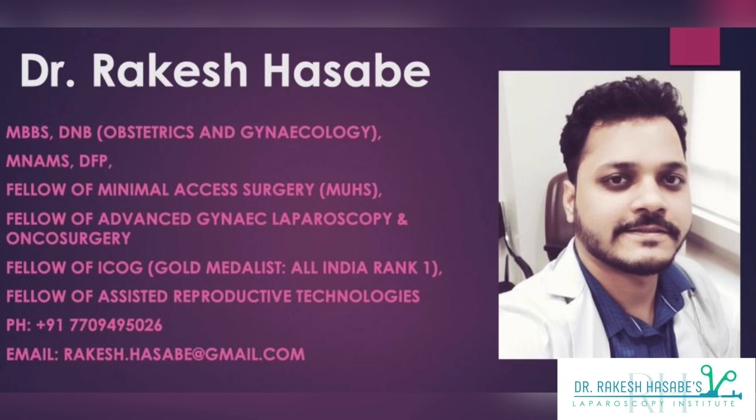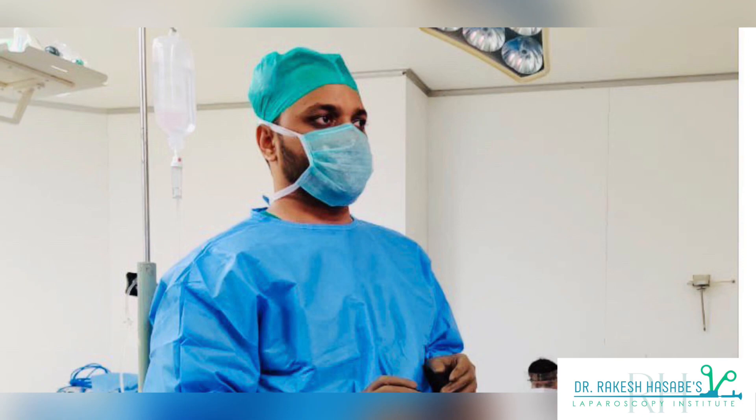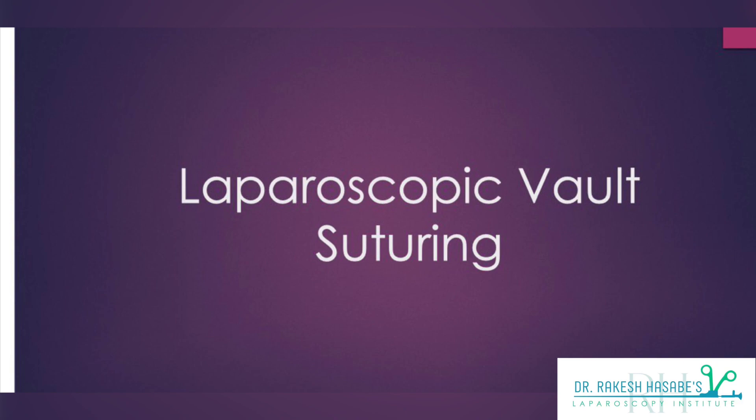Hi friends, welcome to another short demonstration of a laparoscopic procedure. Today I will discuss how to efficiently close a vaginal vault using laparoscopic technique. I will also try to discuss all the simpler ways of performing laparoscopic vault suturing. So stay tuned.